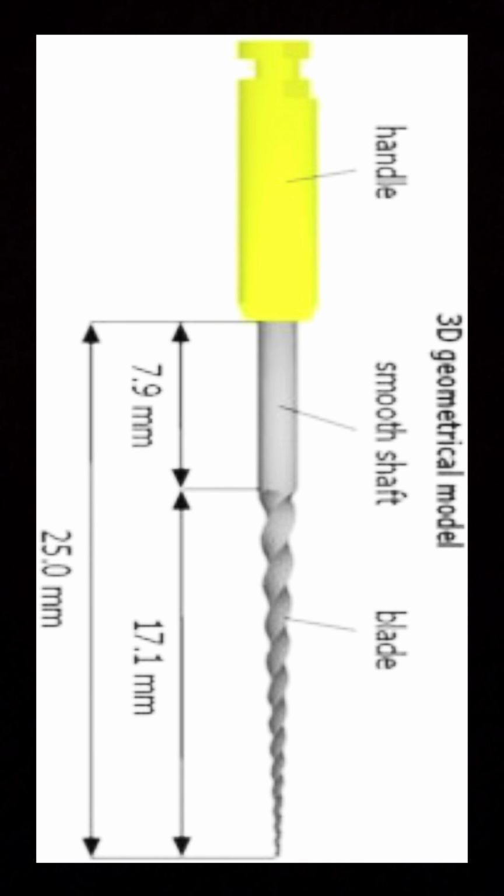The selection of the suitable sized broach for the removal of the pulp and gross debridement is important. A barbed broach that is too wide does not permit removal of all pulp tissue, or it may force the pulp apically as it is inserted into the canal. It may also bind in the canal as it rotates and may thereby break.